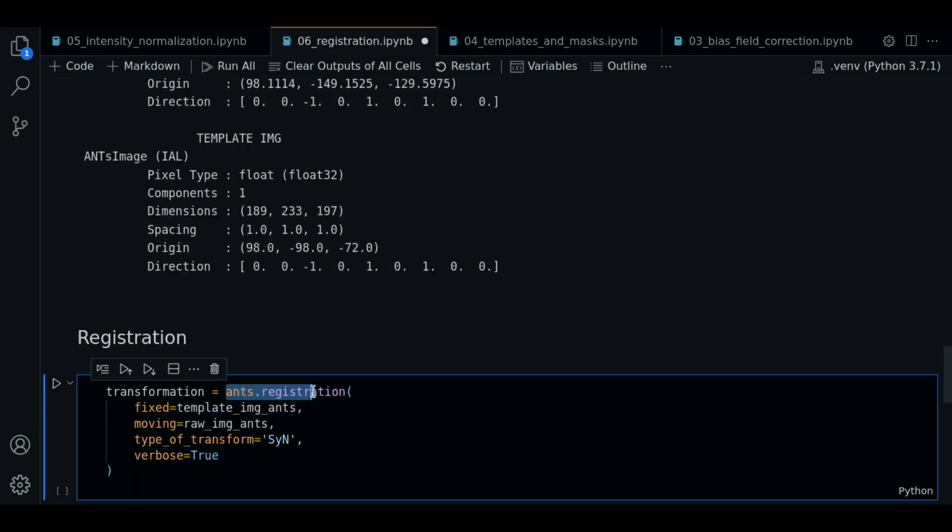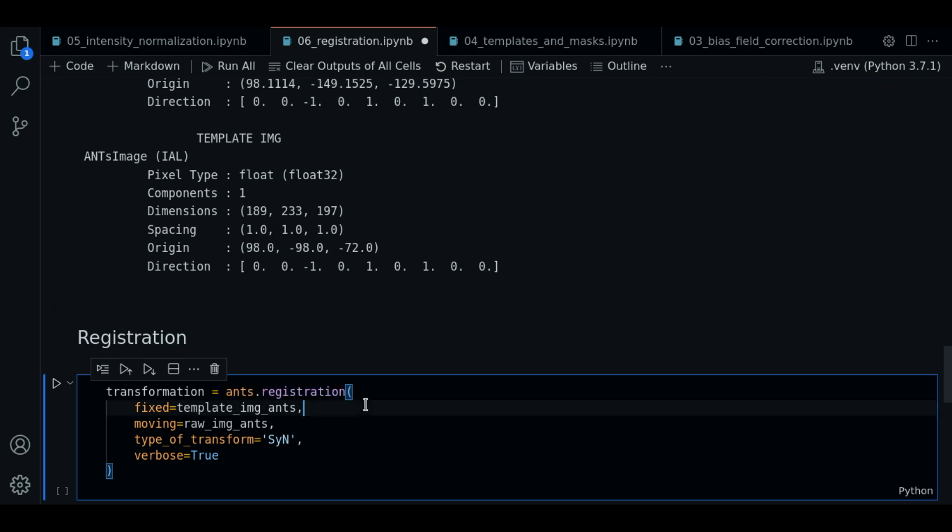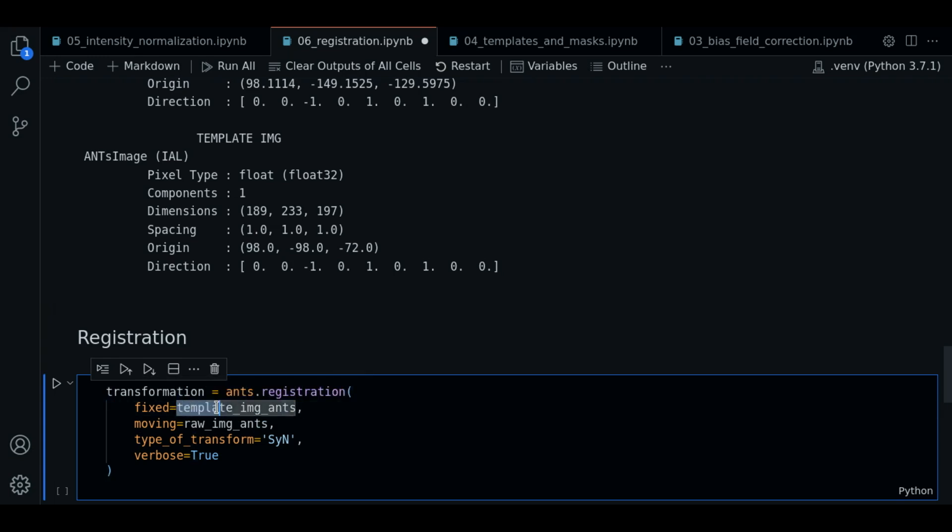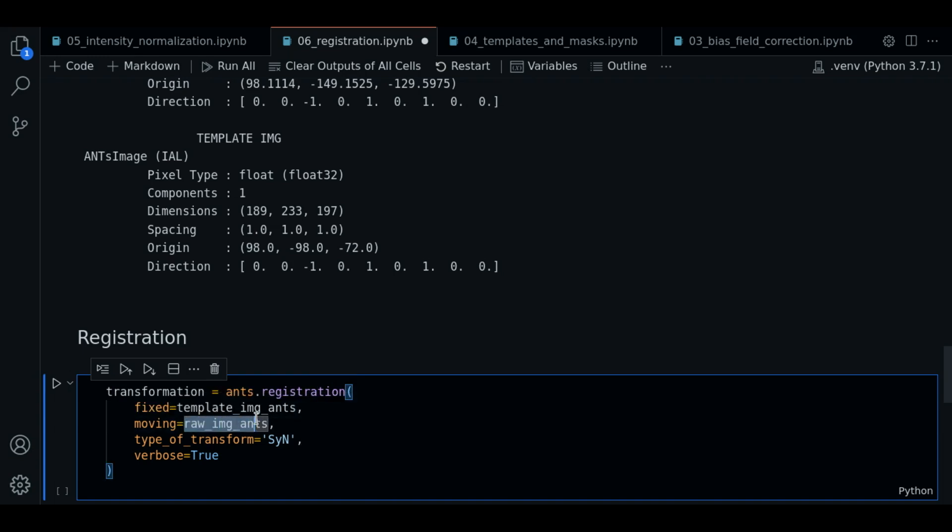Now let's do the registration. To do the registration we call the method ants.registration. We pass as a fixed parameter the template. We're going to pass as the moving parameter the raw image. This is the image we want to transform.